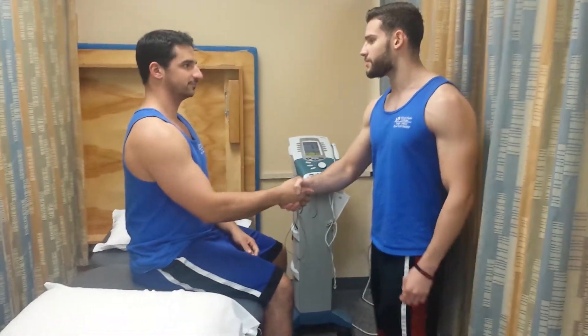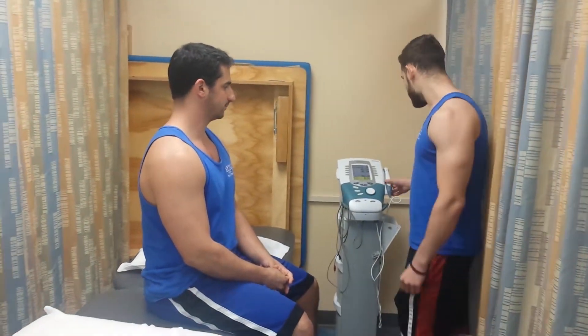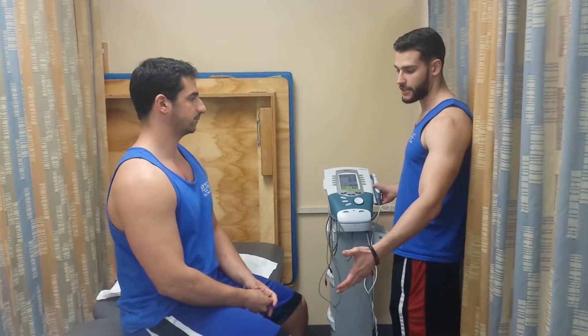So I'm going to be a student physical therapist assistant for today. What we're going to be doing is an ultrasound on your right knee. It's going to help you with your range of motion, improve your circulation, and also decrease some of that pain that you're having.